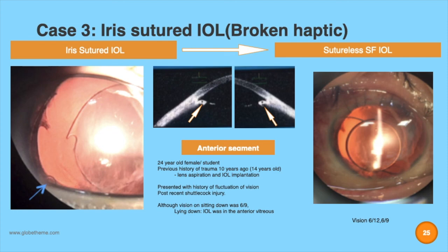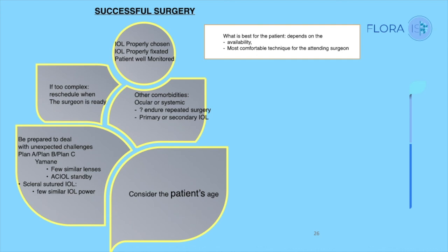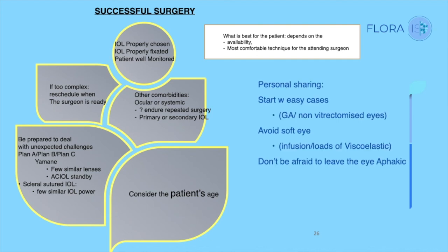We performed vitrectomy followed by explantation of the IOL. Sutureless scleral fixated IOL was implanted using the Yamane technique. Her vision post-op was back to 6/12.